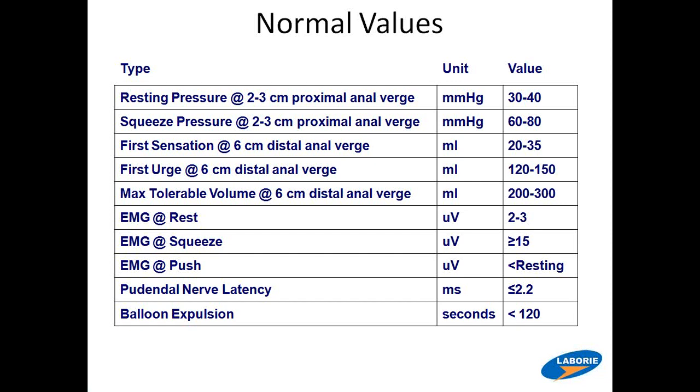And if it's lunchtime, and I do a lot of mine in the afternoon sometime because the fluoro unit, I do defecographies too, and that unit's being used. So I will tell them, eat your breakfast, then do your Fleet's enemas, come on in, and you can sip. She could have orange juice or something if she's diabetic.